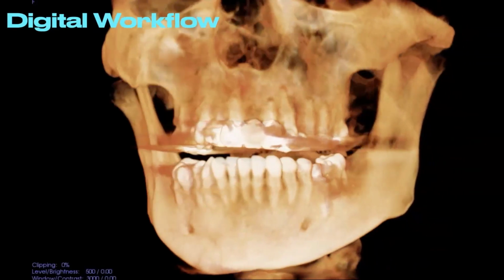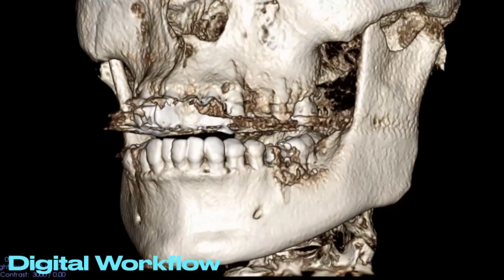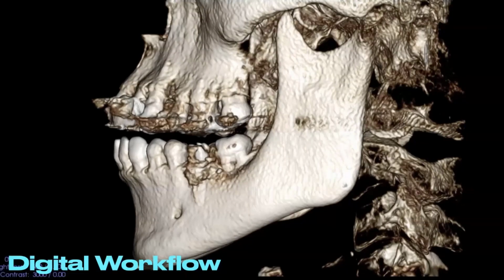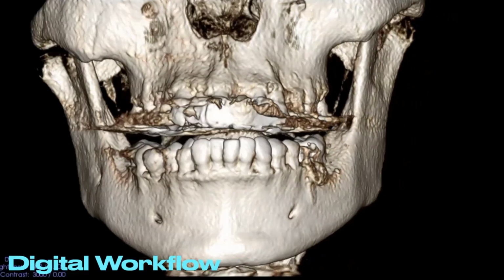And so, in the same thing like this, we can take our 3D rendering and take a look and say, wow, that buccal graft looks pretty big, pretty thick. We got our implant right in the middle of the bone. We're happy. And we can take a look at that as well in the bone rendering, and really take a look and say, okay, our implant's right as it should be. I don't see threads through the bone. I can see that we added bone on the buccal aspect where we needed it, which is towards the crest. Our implant's in the middle of the space, and we're happy.